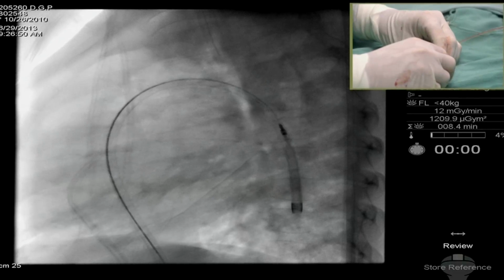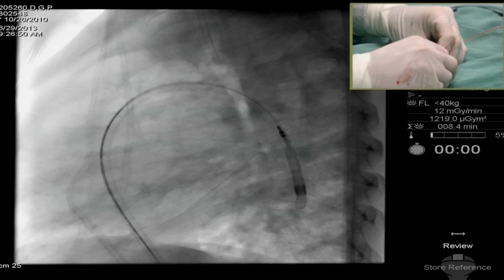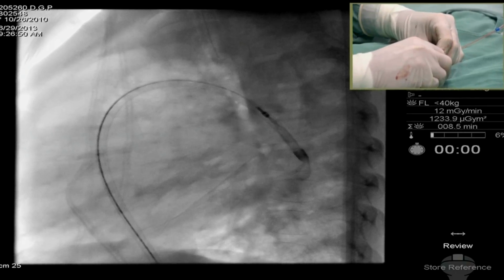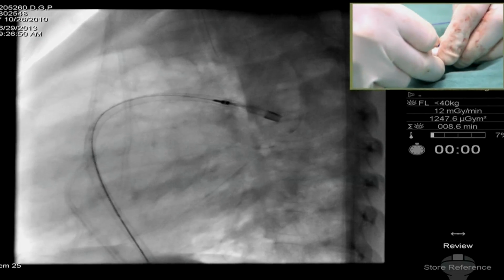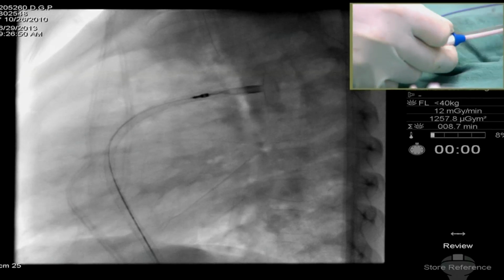And slowly pushing the retention disc out. Yeah, and bringing everything back at the same time. So make an onion shape. While he does that, he's going to push the skirt. Magnify. Bring everything back. Back, back, back, back, back. Yeah, just a second now.